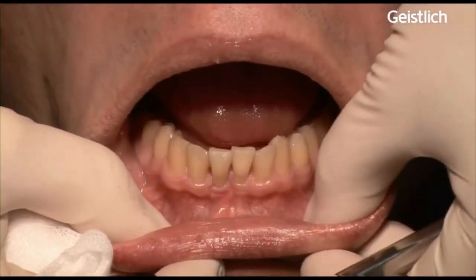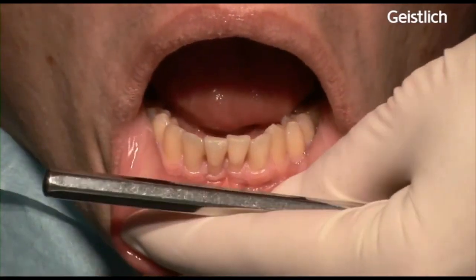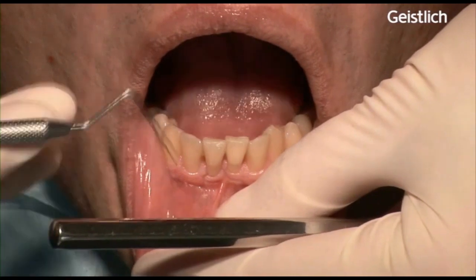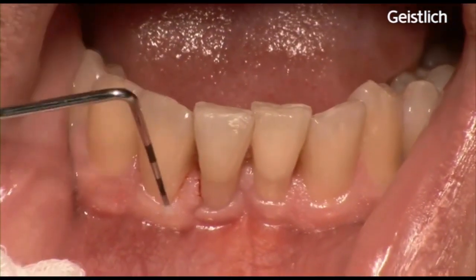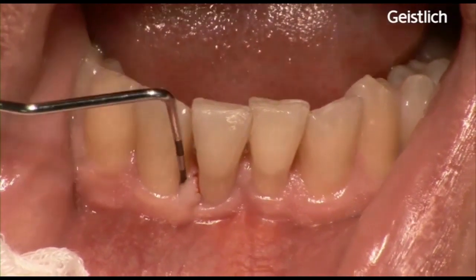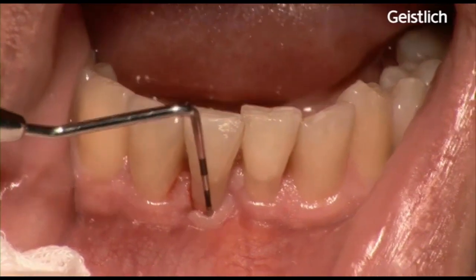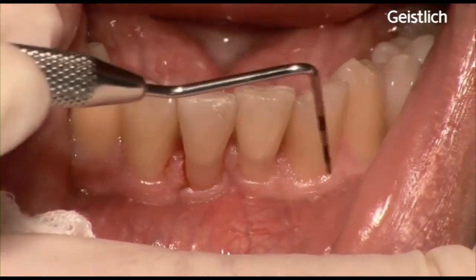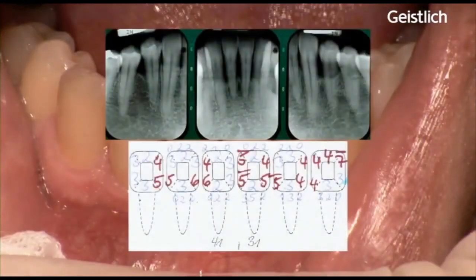In this patient, an adequate band of keratinized tissue is necessary in the lower front, as you can see from the measurements with a periodontal probe, especially on the lower right incisors. Rationale for the surgery is a gain of keratinized tissue in areas with deep pocketing for vestibular depth, stability of the tissues, and for oral hygiene control.